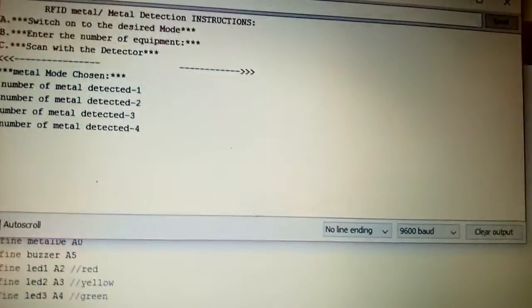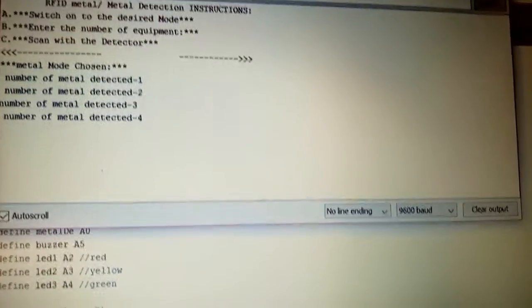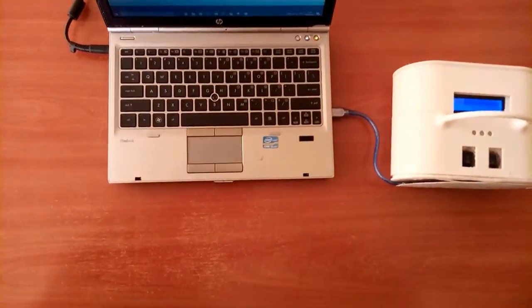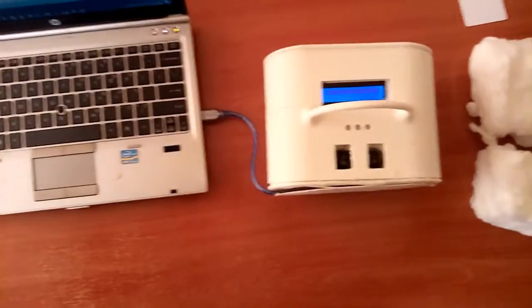and the fourth metal. So these metals, as they have been detected, it will be displaying on the serial monitor so that the health practitioner can know how many metals have been detected, so that he can be sure of the number of equipment.